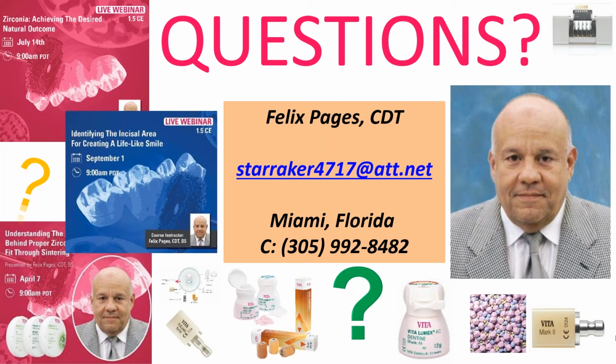If you're going to stain or color something, the surface has to be smooth, because if you try to do it on the gritty porcelain, it just doesn't go right. So I smooth it all down, and then I do that. And I always build up my crowns from the lingual. So I do the lingual incisal edge first, and then like the natural tooth, the dentin goes up in the middle, and then the enamel wraps around that dentin. And so if I have zirconia on the lingual, I have to make sure I bring that up, but it's not perfectly a straight line. I can notch that a little bit with a diamond before I sinter it.